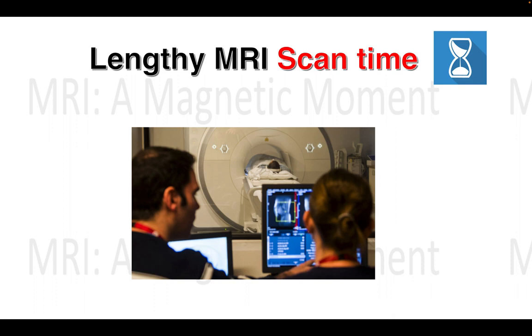Patient motion during MR imaging is very detrimental since each sequence of a scan can be 4 to 5 minutes long, and often the protocols required for diagnostic MR imaging are lengthy, like 30 to 45 minutes, which can compromise the quality of imaging due to patients' movement, discomfort, and change in positioning.